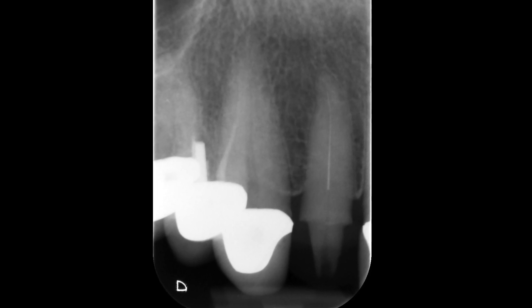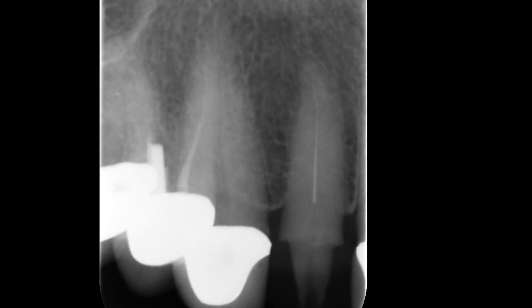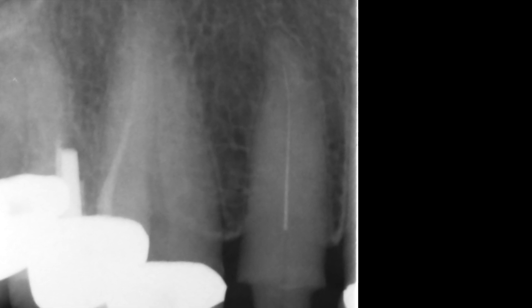Here you can see the preoperative radiograph. There's no periapical periodontitis but I assume the tooth became pulpitic after crown preparation. There's a fine file separated in the root canal. The tooth did not have a temporary in place.